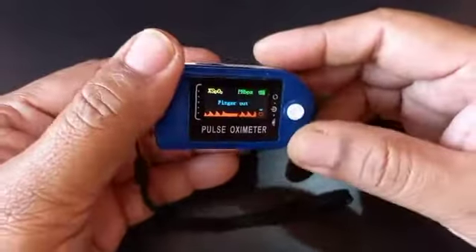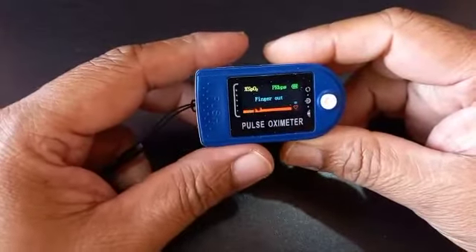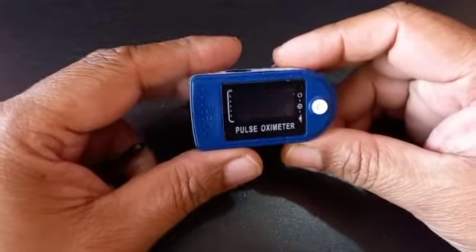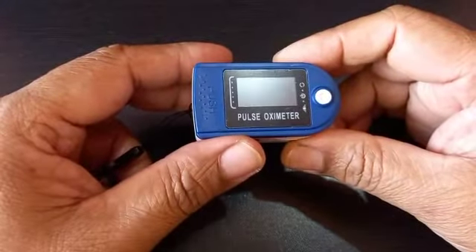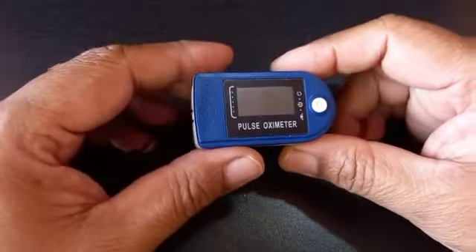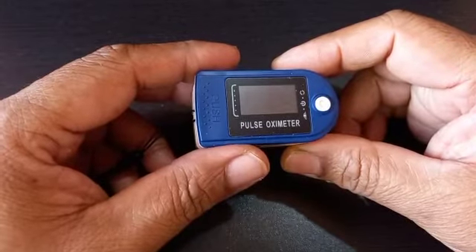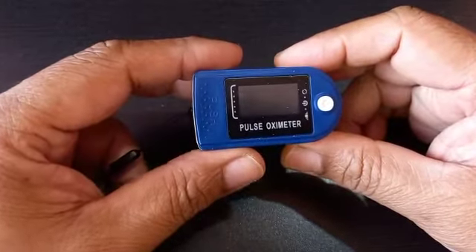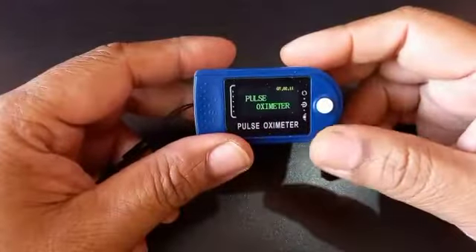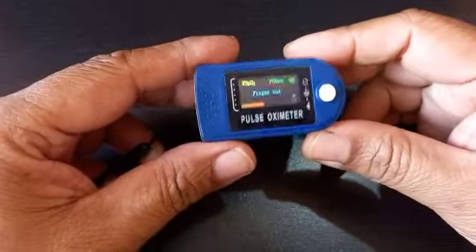Why does this matter? Because if an oximeter is not working well, some companies fix values like 98, 99, or 100 — it will always show some result like 98 or 99. So you will think your oxygen level is fine, but you never know whether it is giving the correct result or not. You need to do these little examinations to know whether it is working properly. This is what I want to tell you.